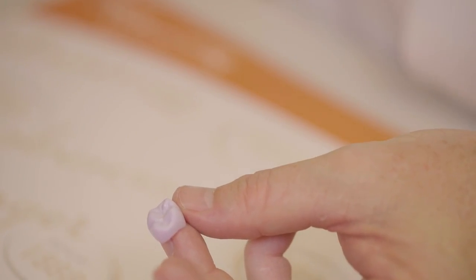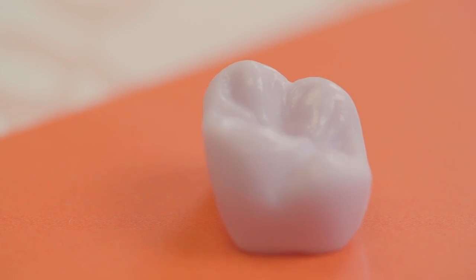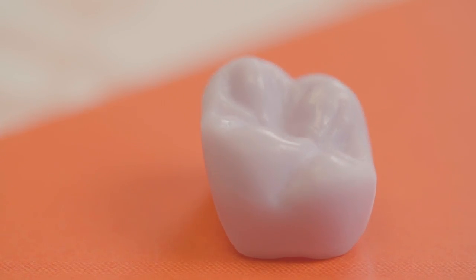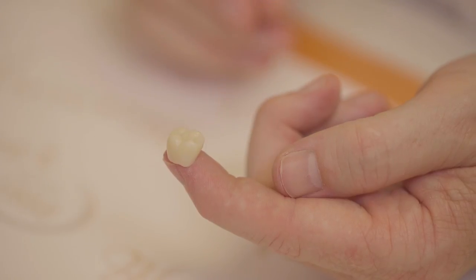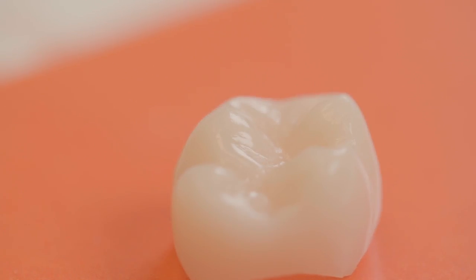It's in the blue state. This is the Emax, and now we can characterize it if we choose to, put it in the oven and fire it, and we're ready to cement it. So what we did is we polished it in the blue state, and we just put it in the oven without any glaze on, without any characterization. We just crystallize it, and this is what it looks like when it comes out of the oven, ready to go in.